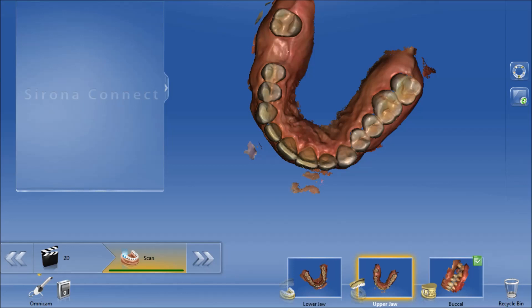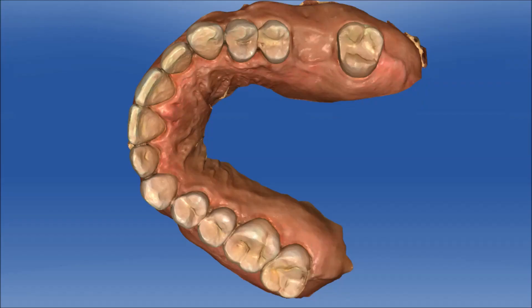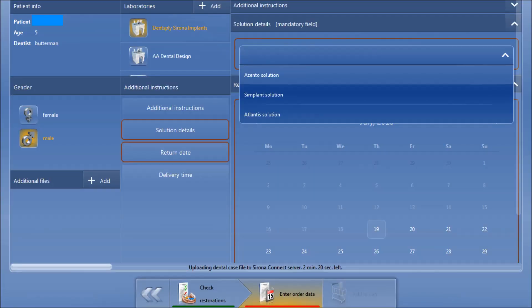From here, we're going to image the arch that we're planning on treating — we do need a full arch scan. We'll image the opposing and the buccal bite. It's critical that we have a nice clean image for our optical scan because not only is the plan going to be created off of this, but the surgical guide is going to be made to fit. So we want to make sure we capture the embrasures and the contours of the teeth on either side of where the implant is going. Even though we are sending a full arch scan, the guide will be approximately three-quarters of the arch. Once we have that scan ready, we can submit this through Sirona Connect as normal.